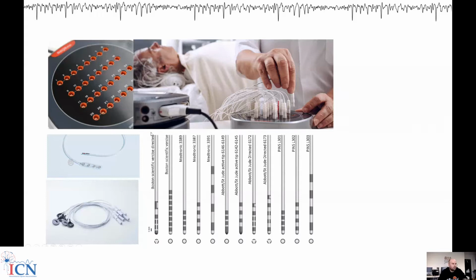But nowadays there are also often Boston Scientific directional leads implanted, or the Abbott directional lead, or the longer Boston electrode. So there are 2 things to note here. One is that not all leads are the same, and the amount and amplitude of signal that you will get really depends on the impedance and the size of the contact.